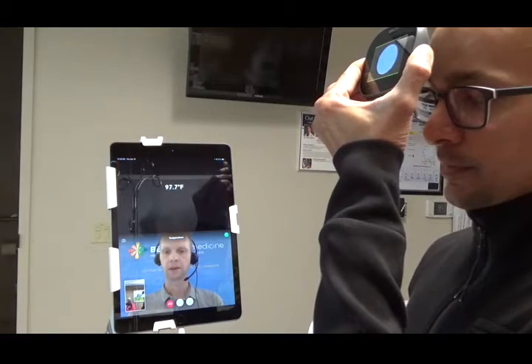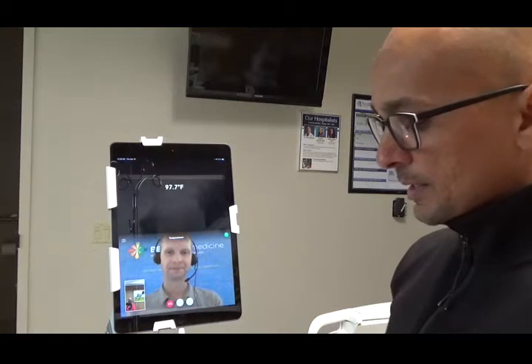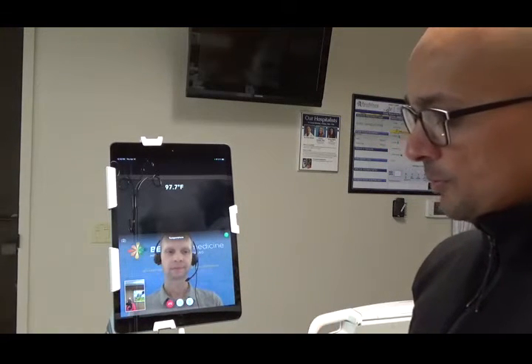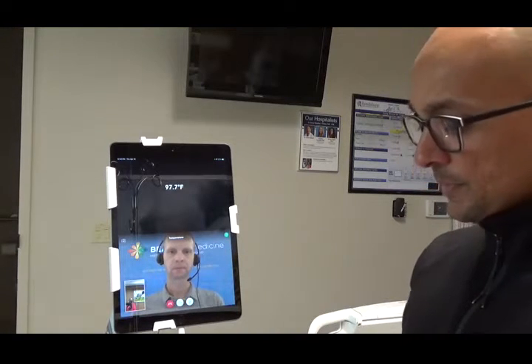Counting down, and we have a temperature. Good. And it's normal. Perfect. All right. So that's the temperature. And next, do we want to do skin while we're at it? Yeah, let's do that. Okay.